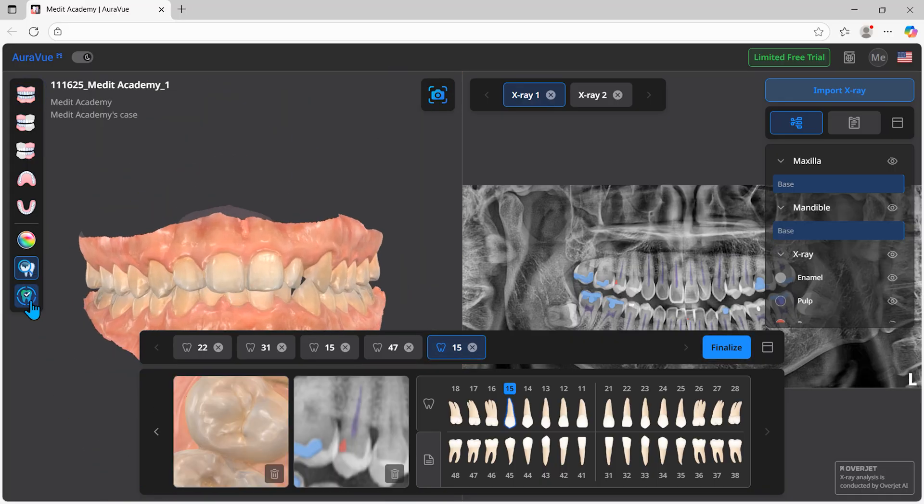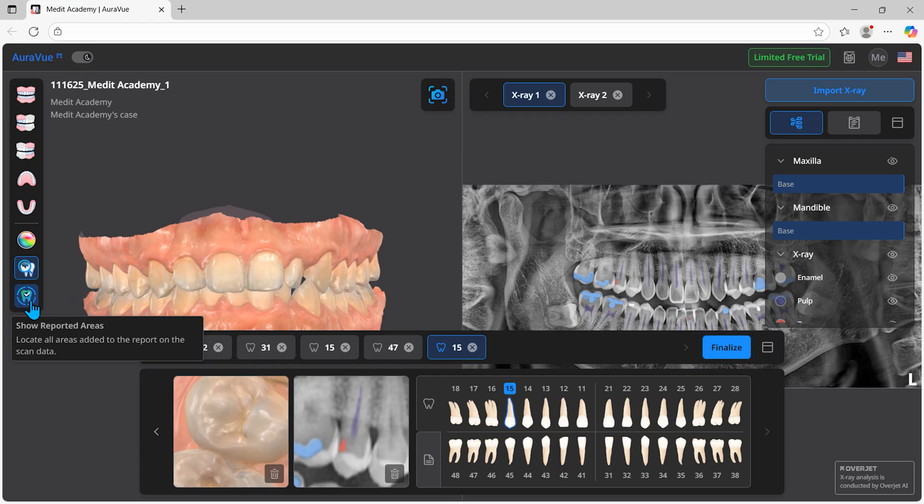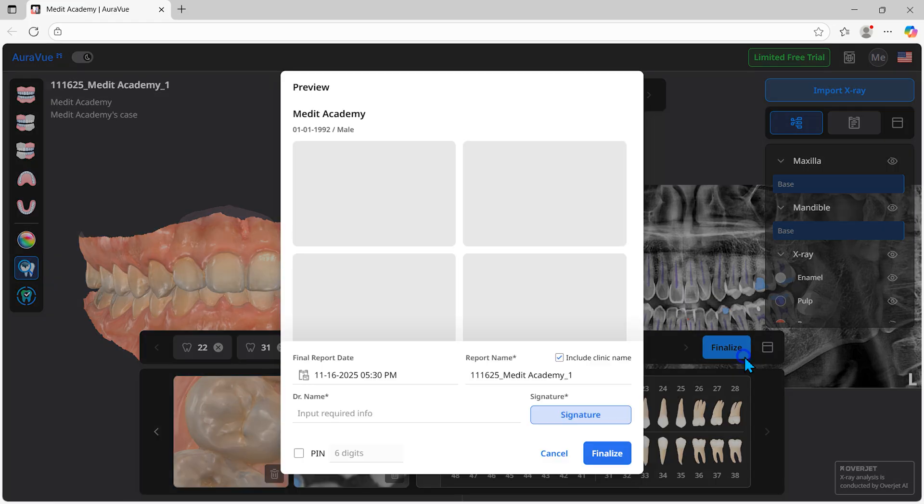Click show reported areas to view all captured areas at a glance. Once you've entered all the required information, click finalize for a preview of the report.